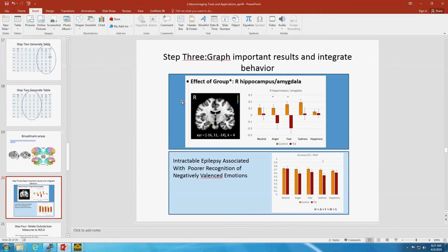The other thing that's important to do with a lot of MRI studies is to look at how it relates to what they do in some task inside the scanner. So usually you have them, if for no other reason than just to make sure they're awake and doing something. Sometimes we just have them push a button every time they hear a bell. We don't care about what they're doing, but just to make sure that they're paying attention. For this one, we had that memory or recognition task. So we asked them what emotion was this.